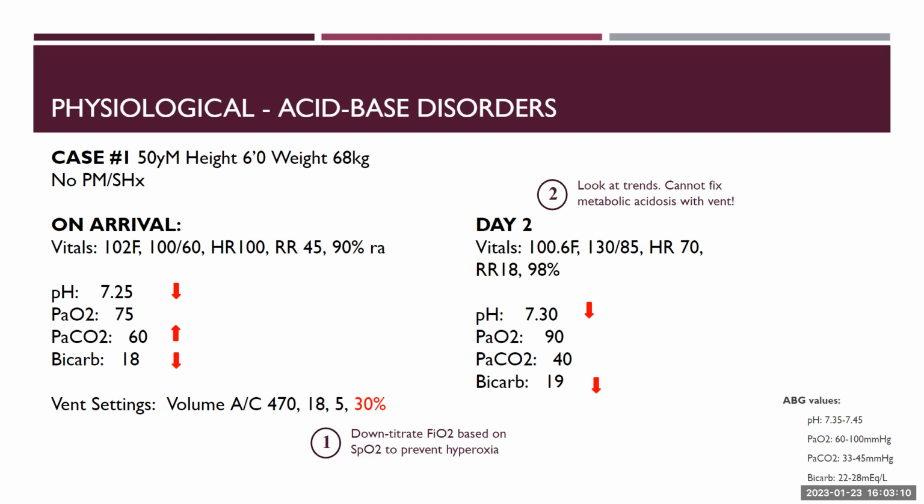However, when the patient's looking like this, we would generally try to be a little bit more conservative and maybe keep them a little bit longer on the ventilator. So it's important to keep that big picture in mind when having this patient on a vent. Again, it's vent and patient. So everything that's going on with the patient is a big thing to keep in mind as you're managing them.